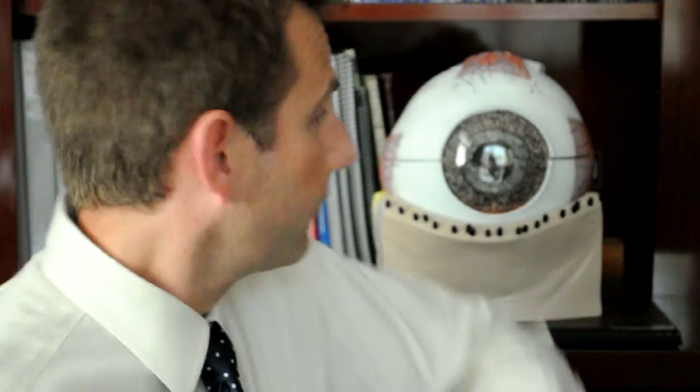With LASEK, we remove the cells from the surface of the eye in a different manner compared to PRK or epi-LASIK. What we do is place a well on the cornea so we can trap alcohol that we place right into the center of this well over top of the cornea.